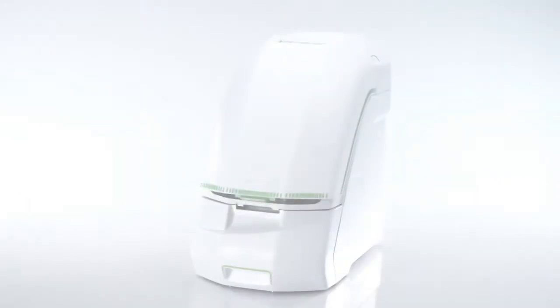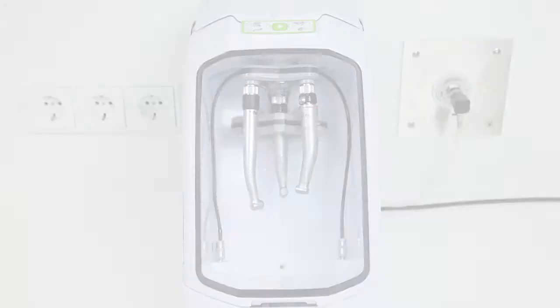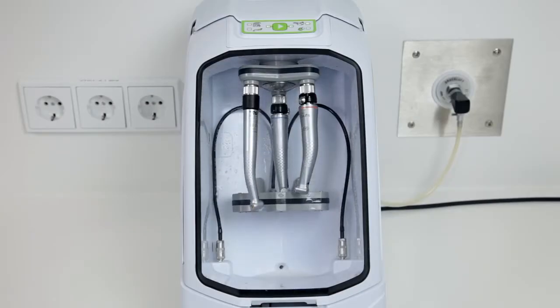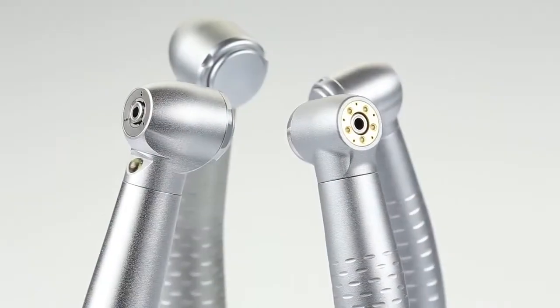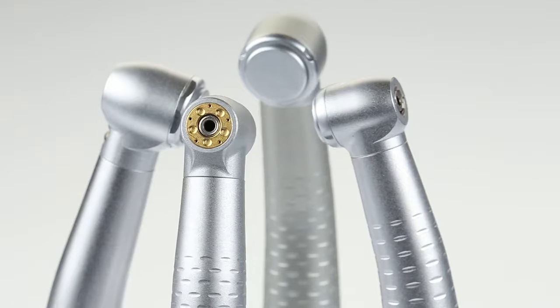Always ensure that the manufacturer provides equipment for the hygienic and maintenance preparation of transmission instruments when deciding on a system. This increases both your safety when using the transmission instruments as well as their service life considerably.